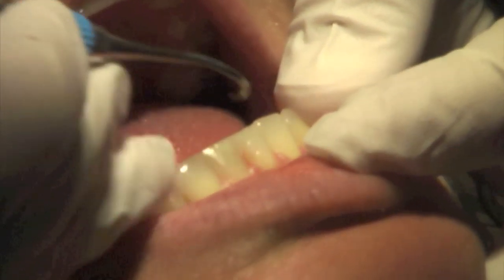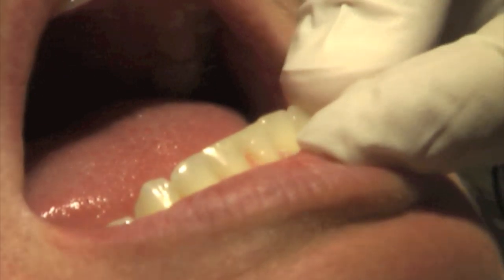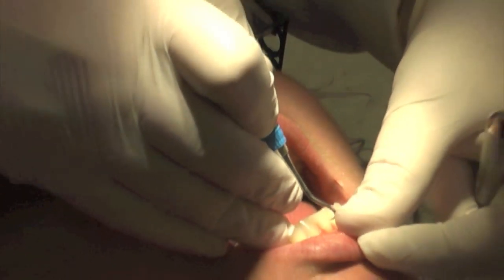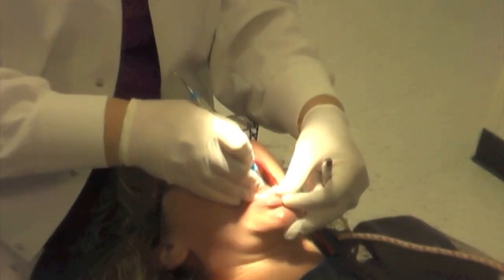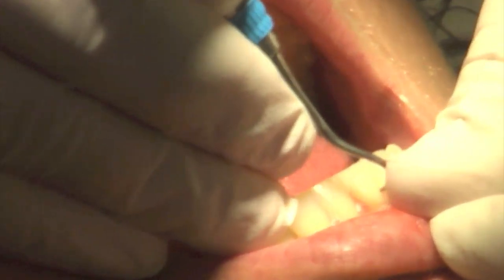However, if I'm going to instrument the distal of 24, sitting at the 11 o'clock position now provides me with the opportunity again to go laterally toward the toe and twist.